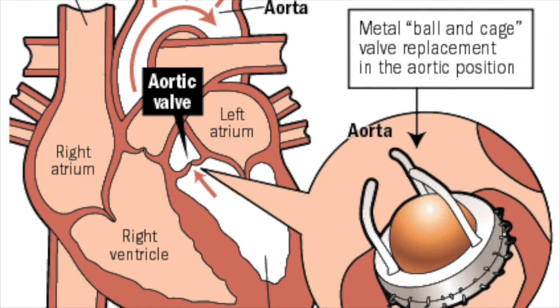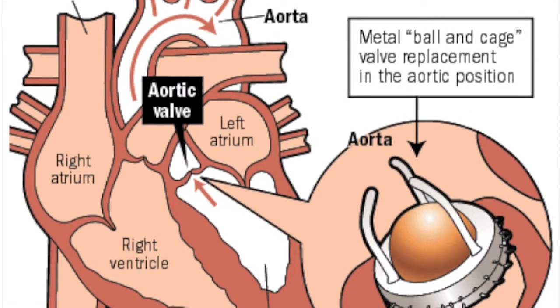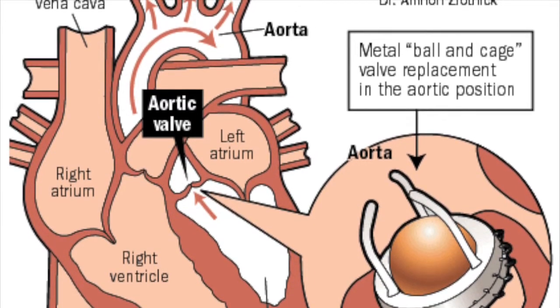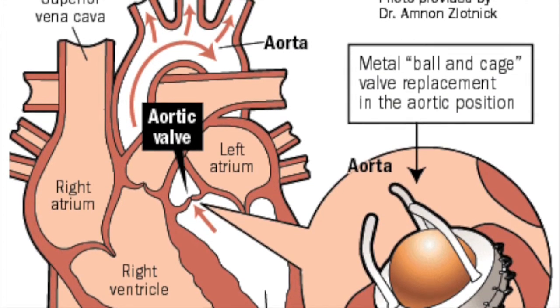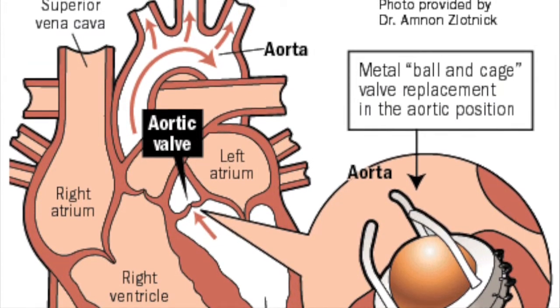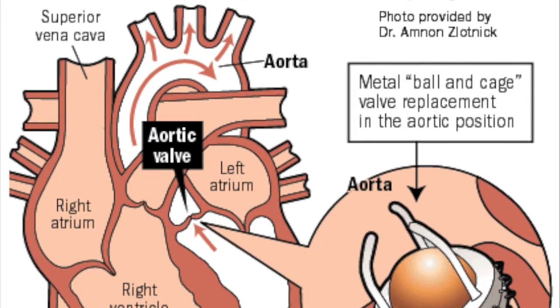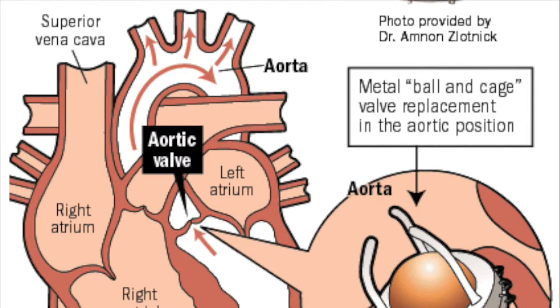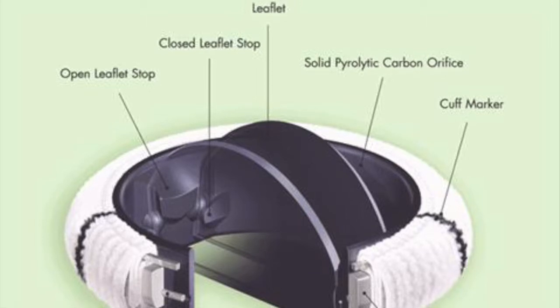Mechanical heart valves, in particular, were first implanted in 1952 by Dr. Charles Hufnagel to a 30-year-old woman. The most utilized mechanical valve today are called bileaflet valves, introduced in 1979. Its superiority from other models is due to its accurate imitation of an actual valve. With bileaflets, blood can flow directly through its center. Bileaflet valves have 2 semilunar discs attached to a valve ring.